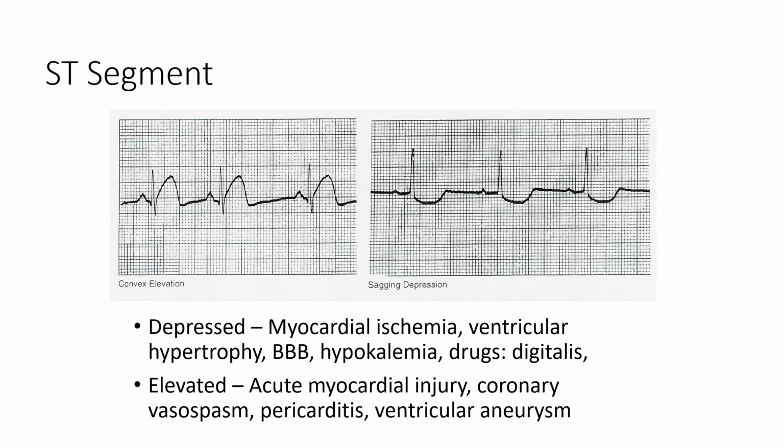ST elevation: if you're looking at ST elevation, you take your isoelectric line and the segment is above the isoelectric line. And again, your ST segment should be isoelectric. ST elevation is usually indicative of an acute MI, or acute myocardial infarction or injury. It also can occur when the coronary arteries are vasospasming.